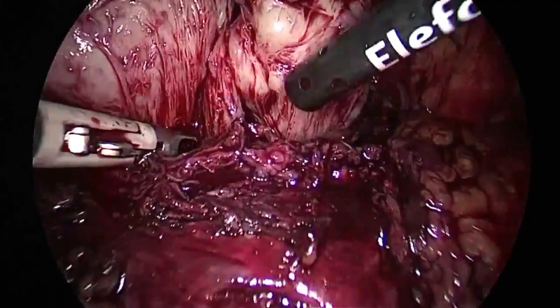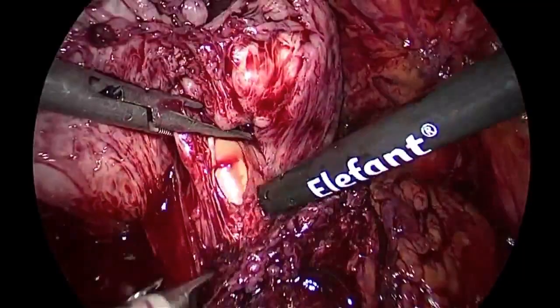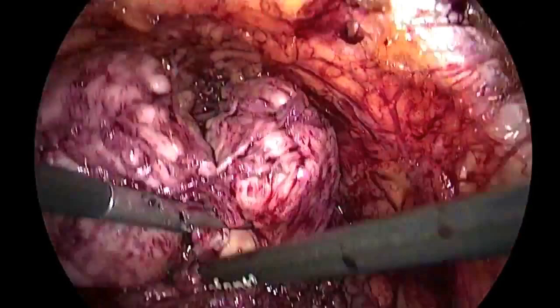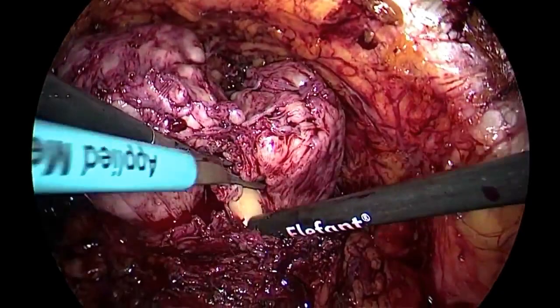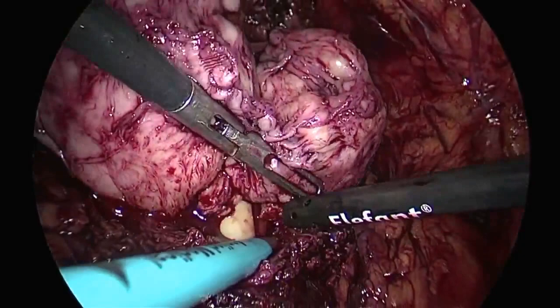Okay, this is the bladder neck, clear. Okay, this is the balloon, inside. Now I perform the incision here. Can you give me scissors, please? And so I remove the adenoma. And so the advantage is, in my opinion, the fact that we don't use energy, and this is for the patients a big advantage because they have no coagulation, please.